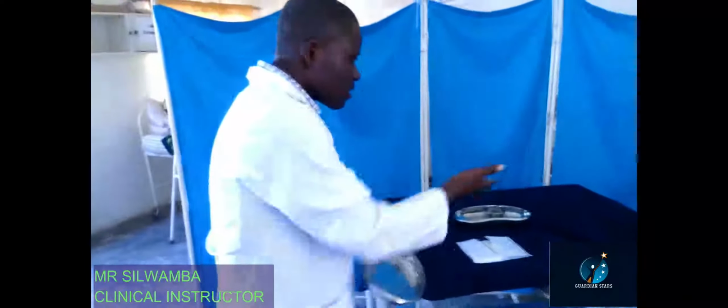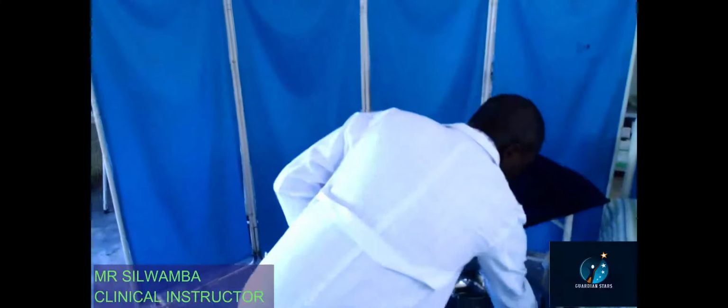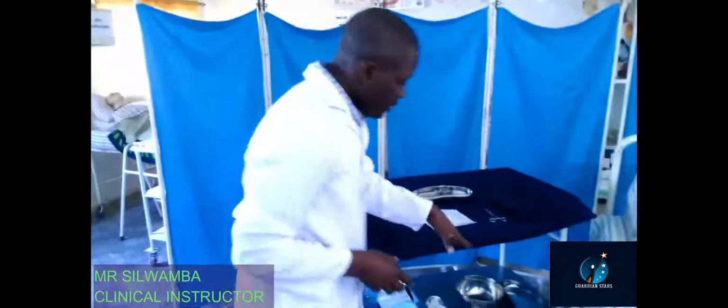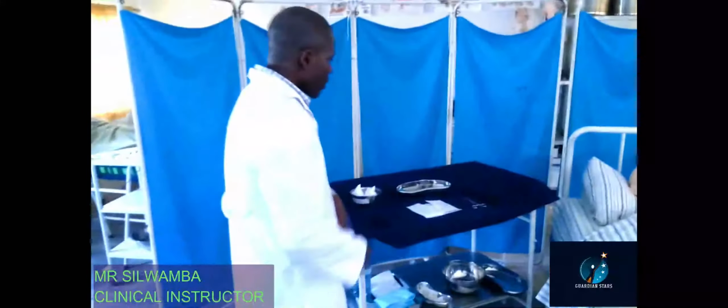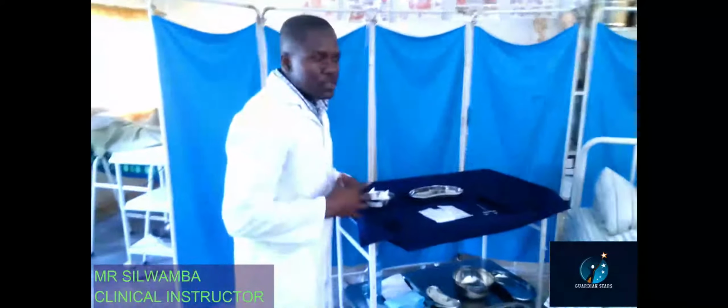Then we have the bowl. This bowl receives the drapes or the hand towels after use. We have a big receiver. This big receiver is for discarding the swabs and the gloves after use. No need of discarding your gloves or your swabs on the floor. You just discard them in this big receiver. So this is our setup and we are ready to go.